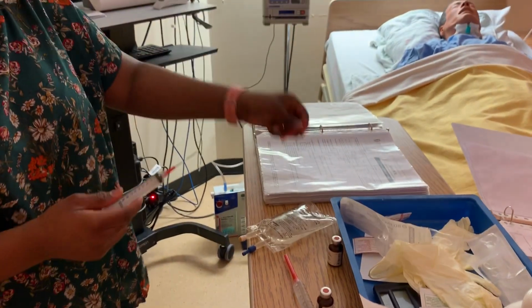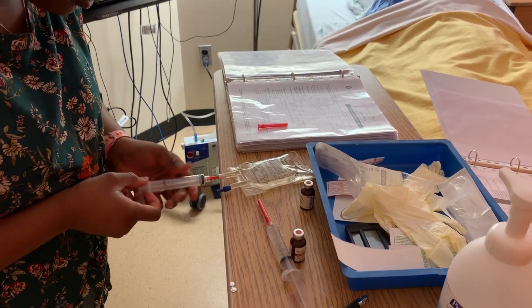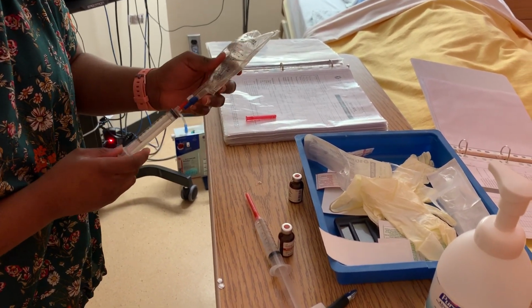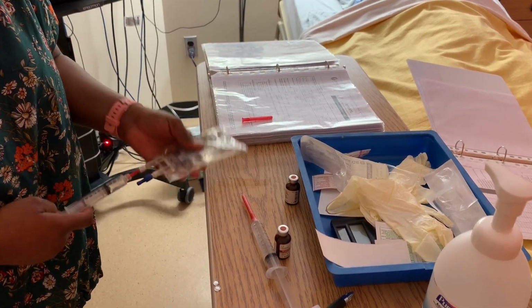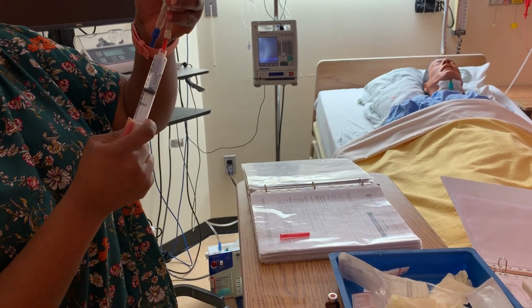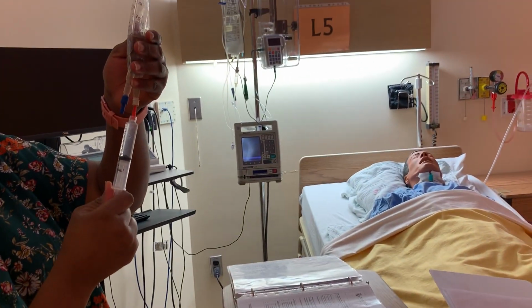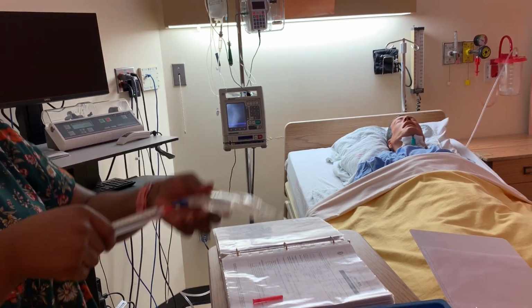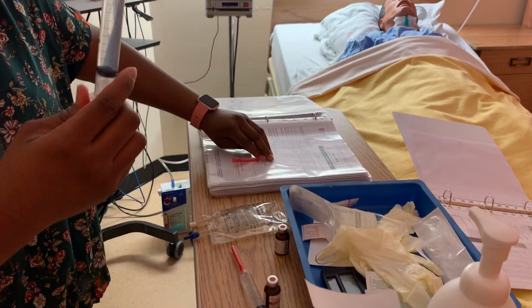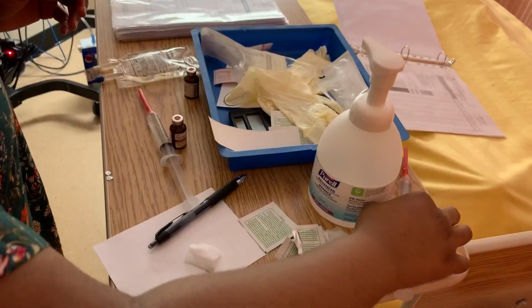So I'm gonna inject this, and I'm gonna make sure I draw up to 10 mLs. Okay, so this is 10 mLs. So I'm gonna get rid of this. I'm gonna get rid of this, so this is gotten rid of.